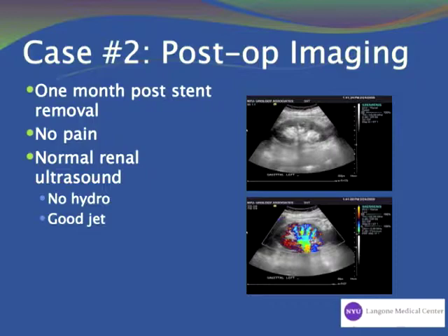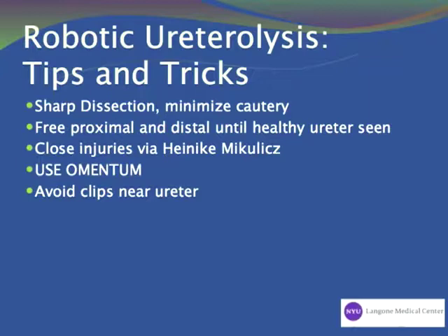Some tips and tricks to ureterolysis: always use sharp dissection and minimize cautery around the ureter. Free the proximal and distal ureters which are normal, then work toward the middle toward the abnormal ureter. Close injuries using a Heineke-Mikulicz technique, and use judicious omentum on a well-vascularized flap.